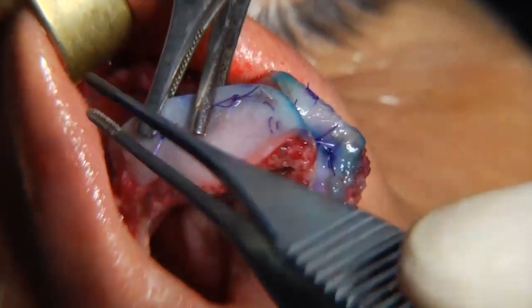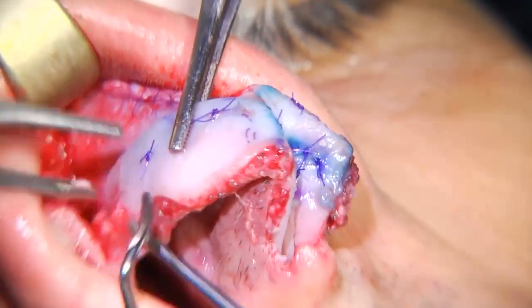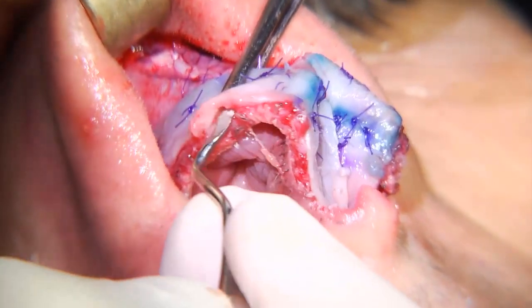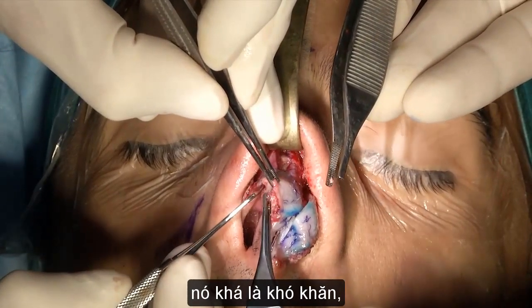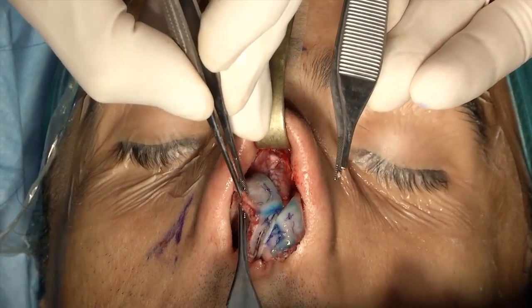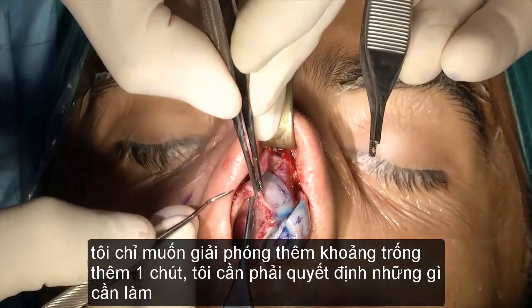Scollino da denti, quello misura grossa. Ancora tutto inserito questo? Sì, lascialo stare inserito. Non volevo scollarlo del tutto. So we have to be just, it's kind of tricky, just a minute, I'm deciding. Quello più piccolo adesso. Da denti. I just want to free a space here and I'll decide what I have to do.